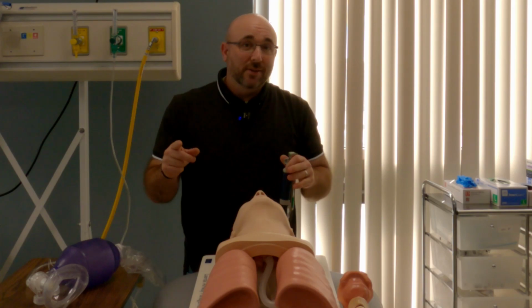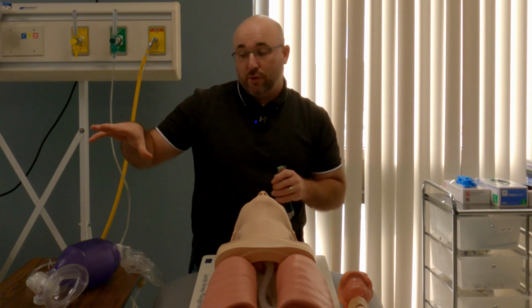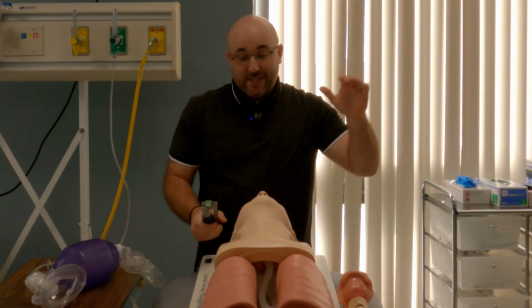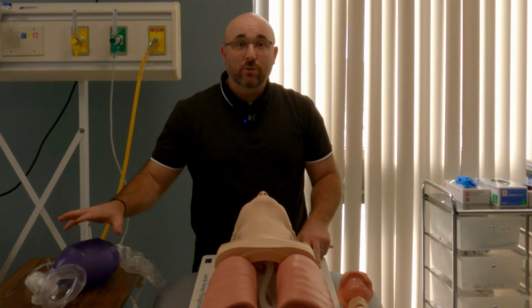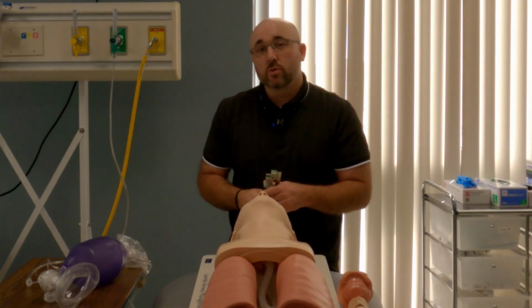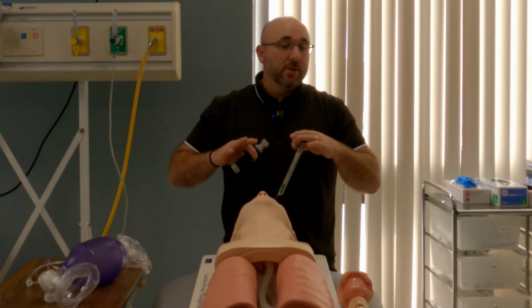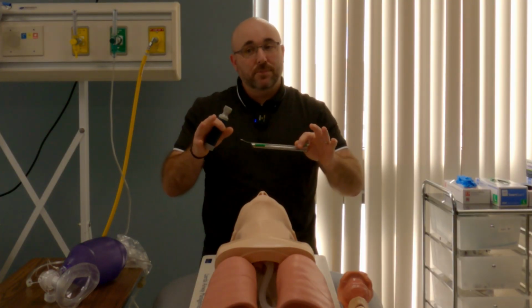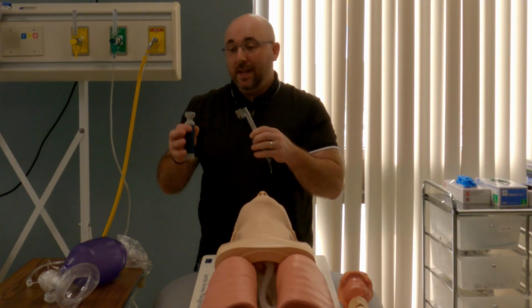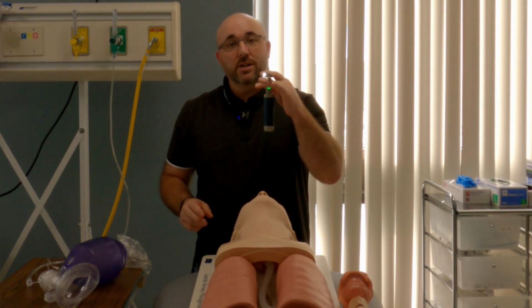The assistant, so this is the key part, the assistant always places himself off to the right-hand side of the person intubating. So left-hand side, right-hand side, the person assisting will be right here where this bag valve mask is. And there's a couple key reasons why you need to be right there. So with the laryngoscope, sometimes the person that's going to intubate doesn't know how to set up certain aspects, although they should. And so having a laryngoscope blade and handle and making sure that they go together and that the light works is really important.